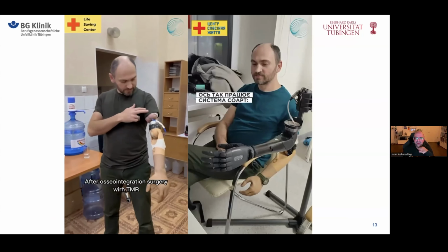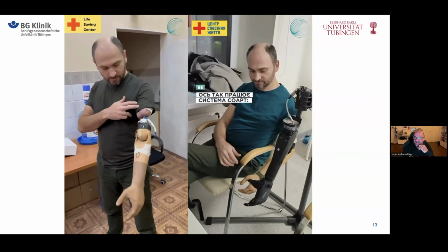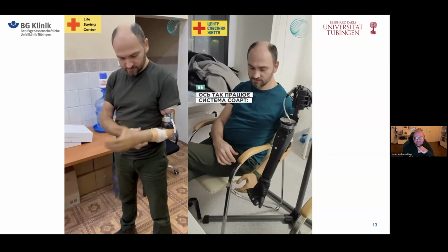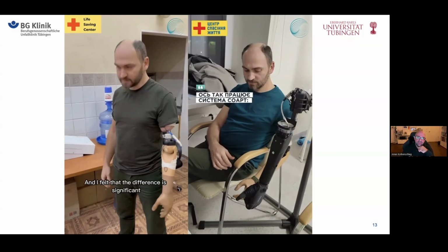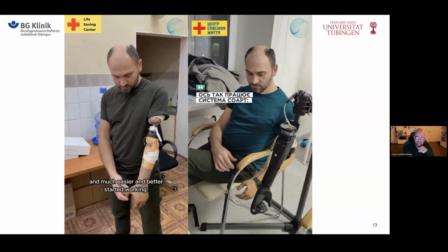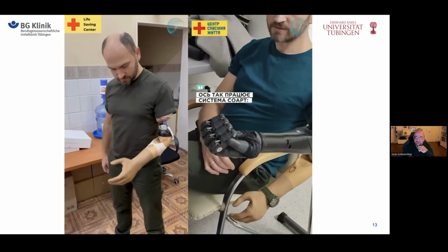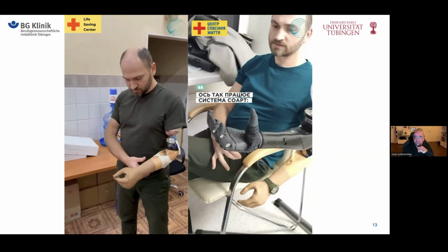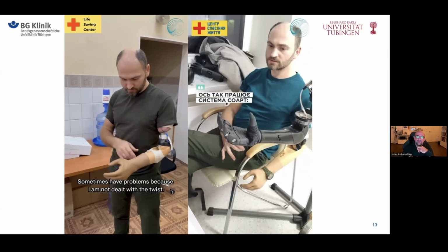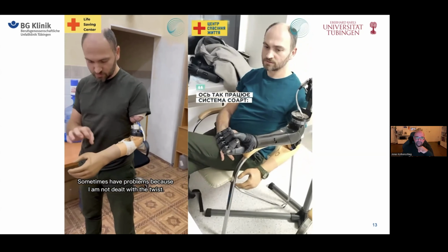And then I keep track of these patients via social media, and you see that he's training and that he's having TMR. It's the first TMR case we did back in the first trip. And it's just great to see how it works and how the prosthesis technician, everything just gets better and helps him, as you saw in the video from Alexander, get better function out of that lost limb.